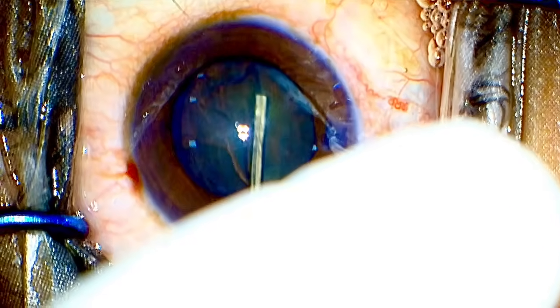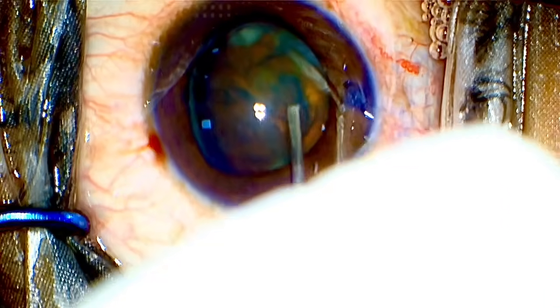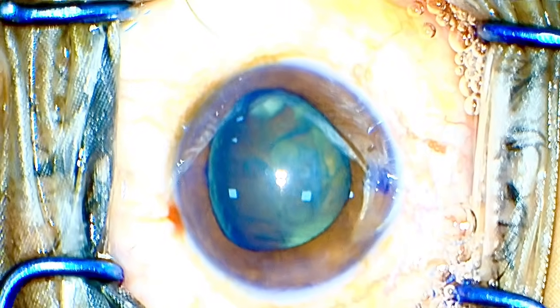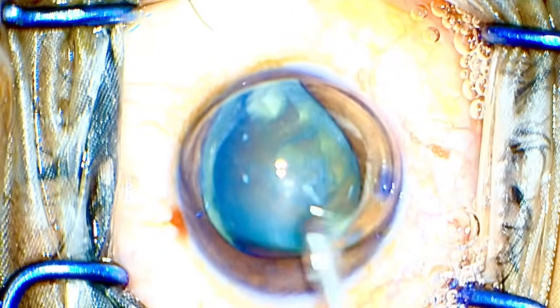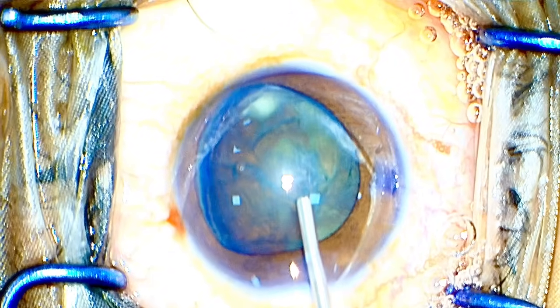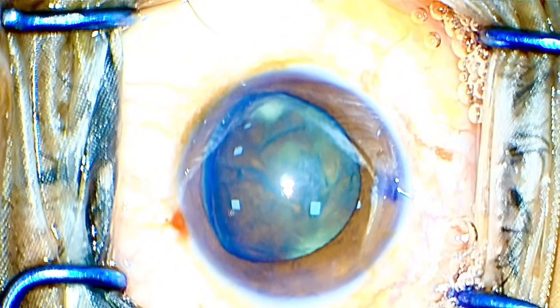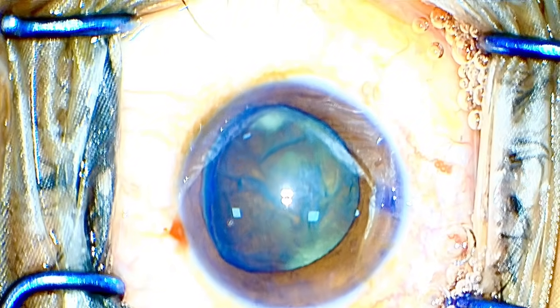For me, it is always the left pole because I am a little right-handed surgeon. It is easy for me to just pick the left pole of the nucleus with my phaco, and I'm putting some more visco to protect the endothelium right now. And for phaco, high vacuum is the most important prerequisite in this case.